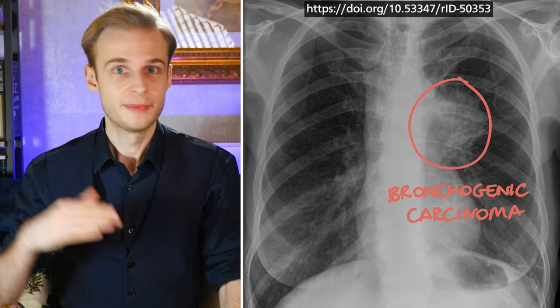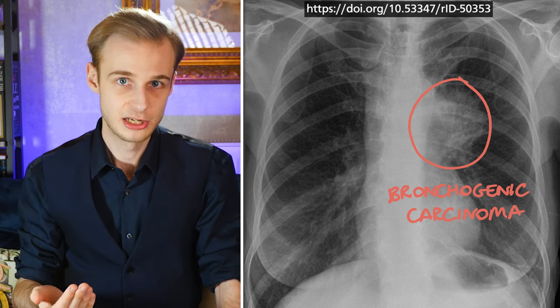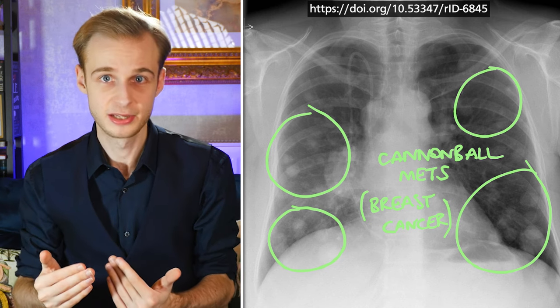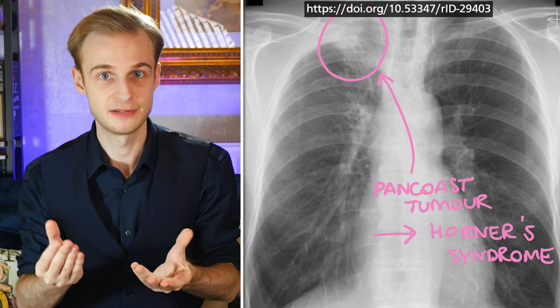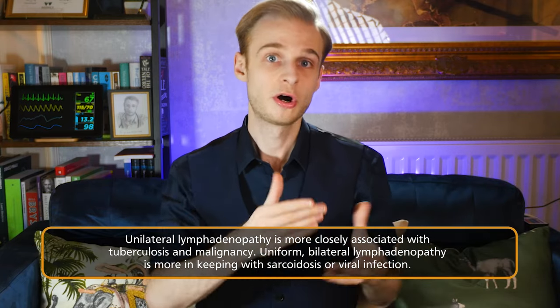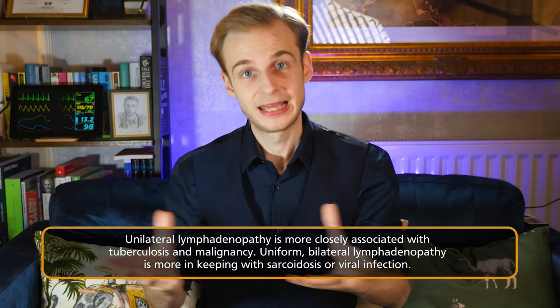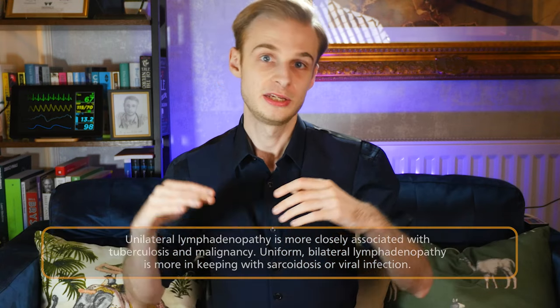Finally, number 10: lung cancer. Cancers are one of the most important things to pick up any time we do a chest x-ray. Different types of cancer — adenocarcinomas, squamous cell carcinomas — can have characteristically different appearances depending on the malignancy. You may see very obvious unilateral opacities and areas of attenuation, small nodules, or more vague areas of consolidation. You may see enlarged lymph nodes more commonly on one side than both. Don't forget to check the ribs for areas of bony destruction if you've got an invasive lesion. On lymphadenopathy: unilateral enlarged lymph nodes are more commonly associated with cancer or tuberculosis, whereas bilateral and uniform symmetrical lymphadenopathy should make you think about sarcoidosis or a viral infection.